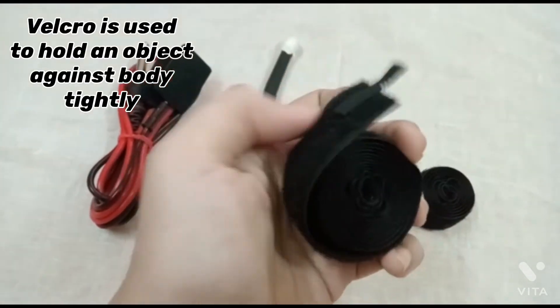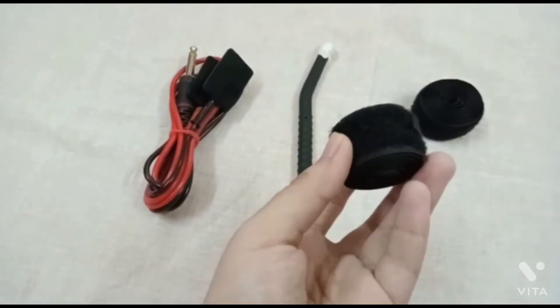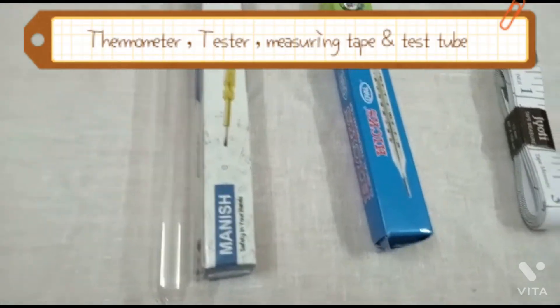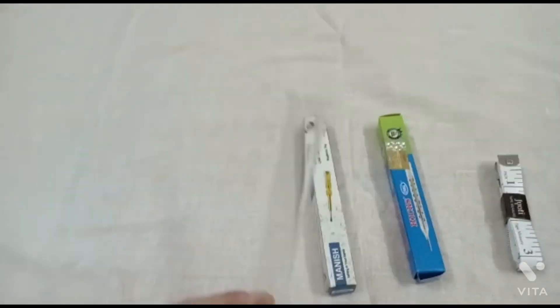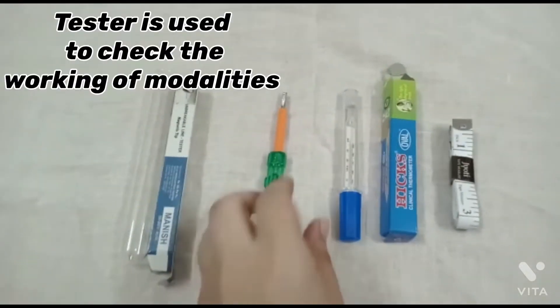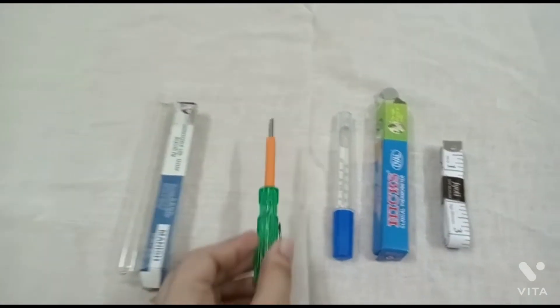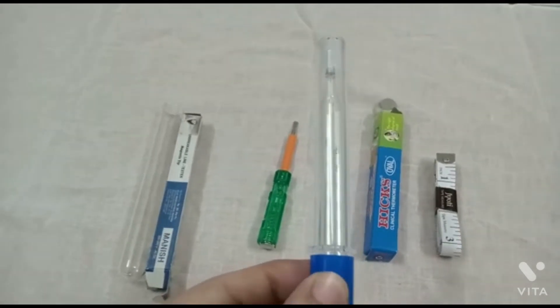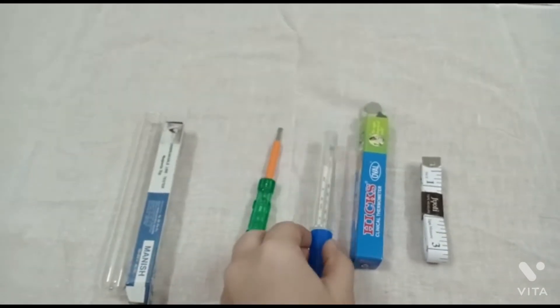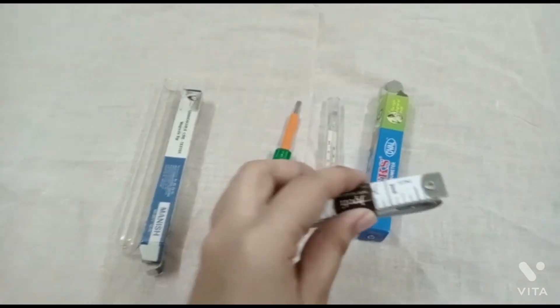Velcro is used to hold an object against the body tightly. Next are the thermometer, tester, measuring tape, and test tube. The tester is used to check the working of modalities. Obviously, everyone knows why a thermometer is used. The measuring tape is used to measure chest expansions.